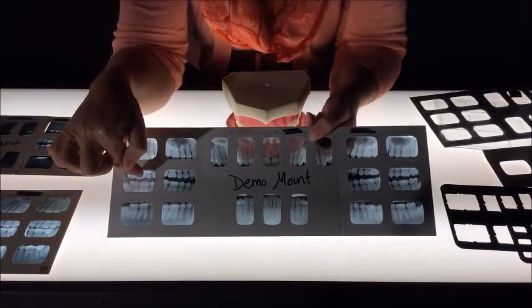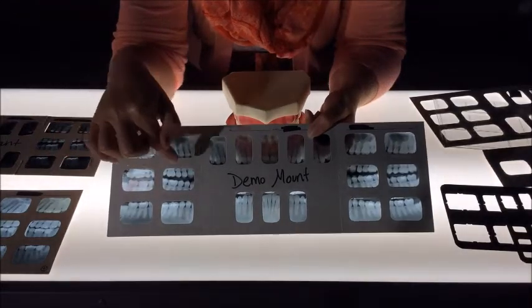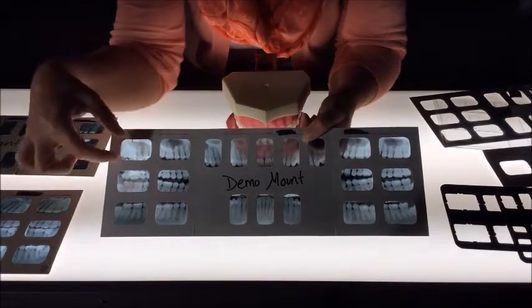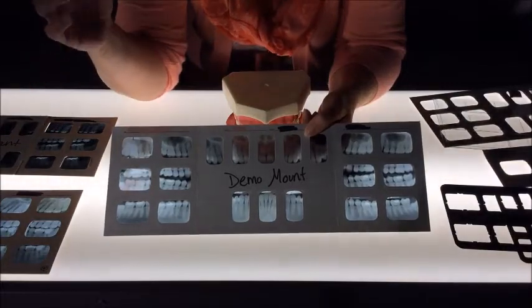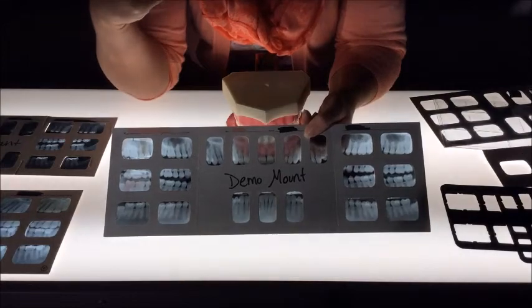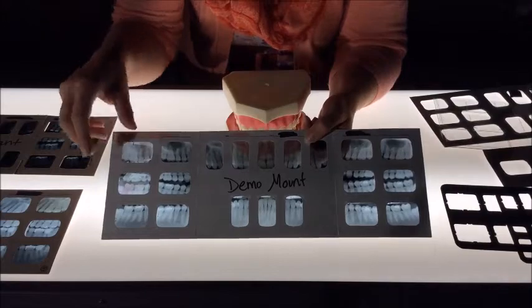When we start film mounting, we usually start by mounting the interproximal bite wing radiographs on the patient's right or left side, and then we proceed to do the other type of films, which are known as periapicals. Periapical, peri meaning around, apical being the root of the tooth. So when we're mounting films, we have two types of films, bite wings and periapicals, which would be helpful for you.